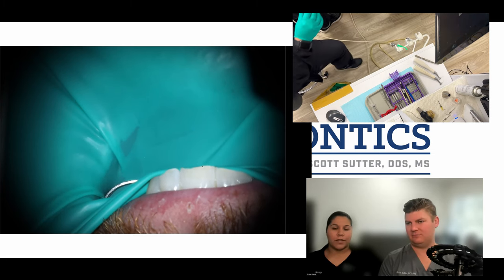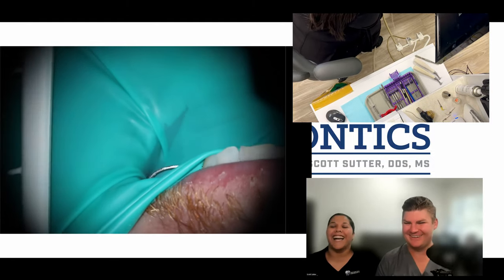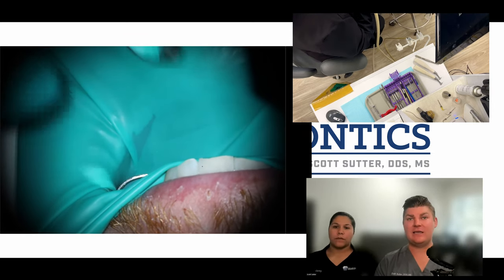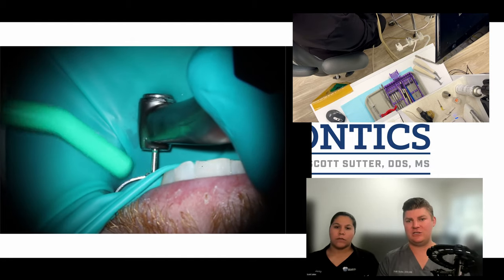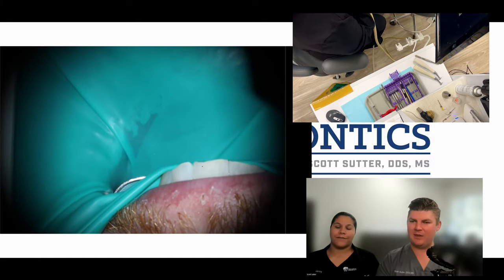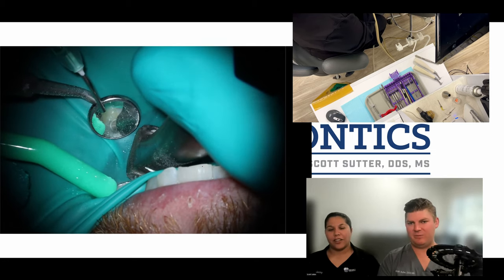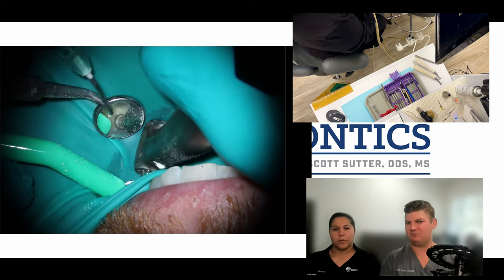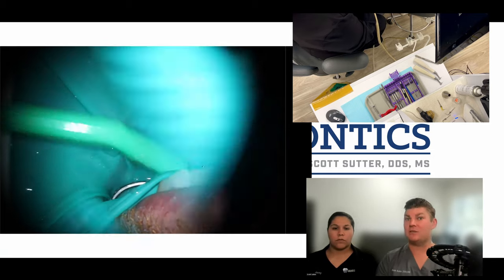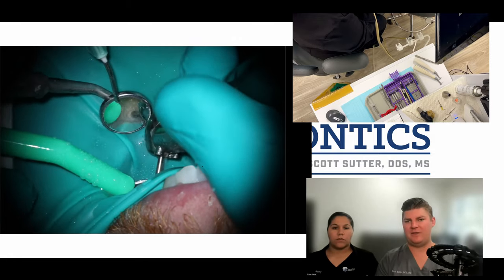On my end it's just suction and keeping his mirror clean. One of the reasons we love having that side scope for our assistants is they can see exactly where my mirror is, so Jenny does a really nice job rinsing off any water going on here. I forgot to turn the water on — that's what I'm doing right now. Her suction is pretty much right next to the tooth just to the distal, keeping my mirror nice and dry so we don't have to keep wiping it. The mirror magic coating makes a huge difference, creating that hydrophobic surface.